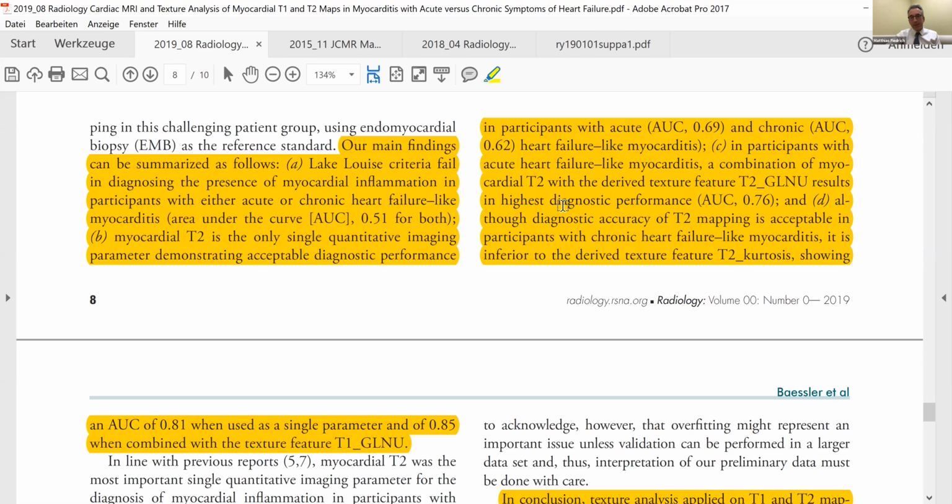Of course, you already mentioned some of the potential limitations. Is endomyocardial biopsy really a very good gold standard? We don't know for sure, because with all the things that we think are the gold standard, who validated that against what? So it is always difficult. That's why I think even if it doesn't look perfect, it may be an error more on the biopsy side and not on the side of the algorithm to detect the inhomogeneities.